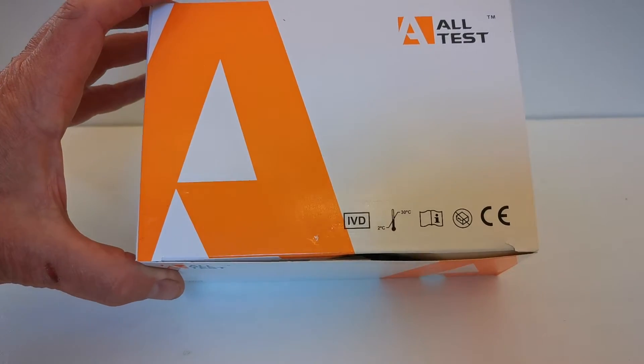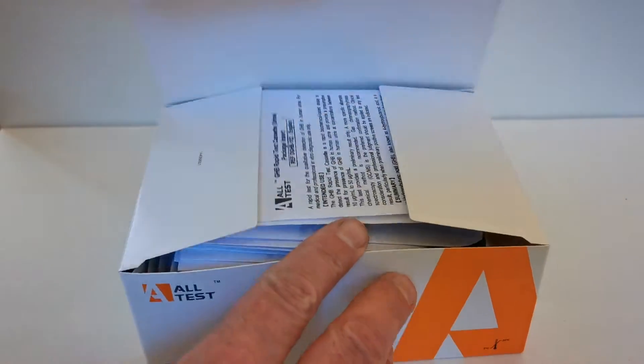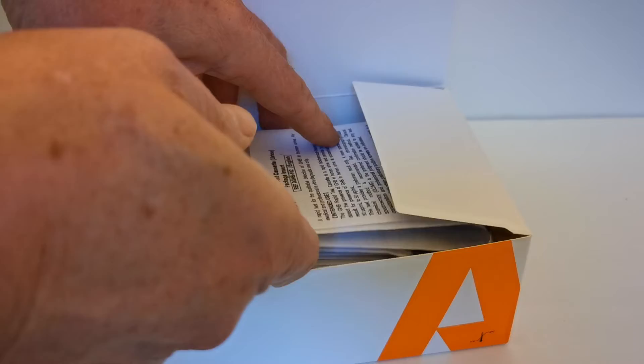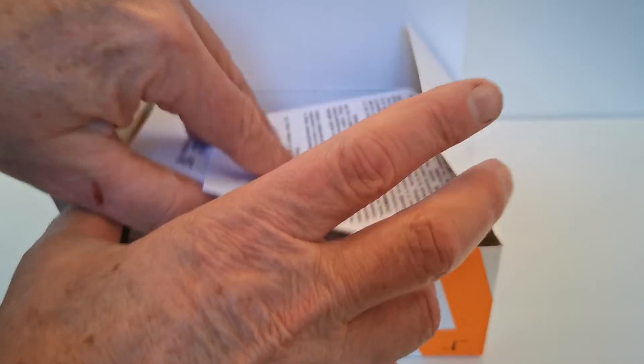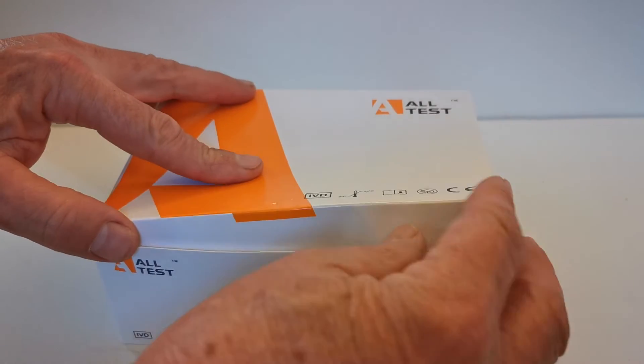This is the full all-test carton as you can see. Standard pack box, data sheet inserts and 25 of the test cassettes.